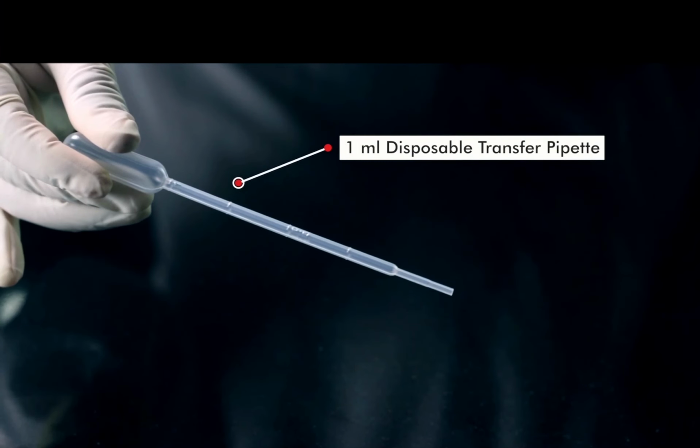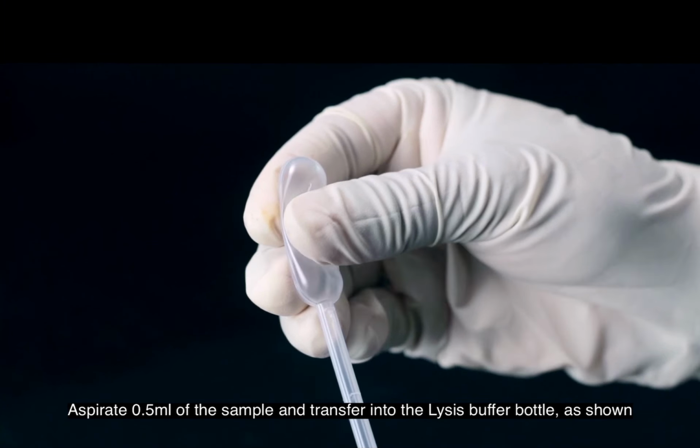From here we have to transfer 0.5 ml, only 0.5 ml. In the middle you can see the 0.5 ml marking. For any pipette, the basic step is, please press the pipette fully and then only insert it below the sample column, the water sample column. Because if you insert it into the sample and then you press, what will happen? Aerosol generation, bubbles will form. It's a risk for you, and also if there are a lot of air bubbles, it will interfere with our test. So please always press the pipette first and then insert it into the sample.